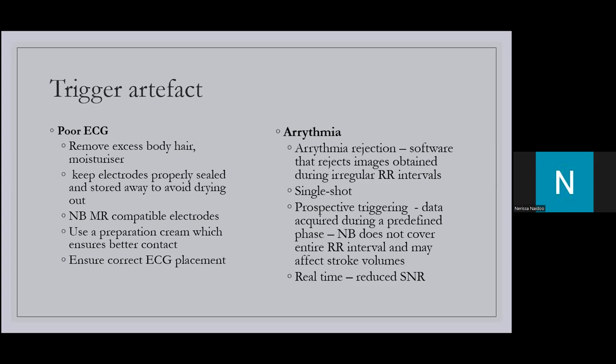Ensure that you have correct ECG placement. If you see that you are not getting a good ECG reading, please redo it. You'd rather spend those extra few minutes repositioning your electrodes than starting your scan and starting from scratch all over again. I would rather take that extra time initially, and then once you've started, it's just go, go, go.